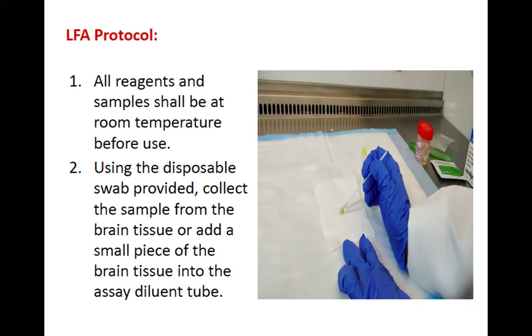Let's say you're working with blood samples, serum samples. You have to think of a protocol so that you obtain the most concentrated antigen, because working with test strips, they are not sensitive. So you have to optimize your sampling procedure. Okay.